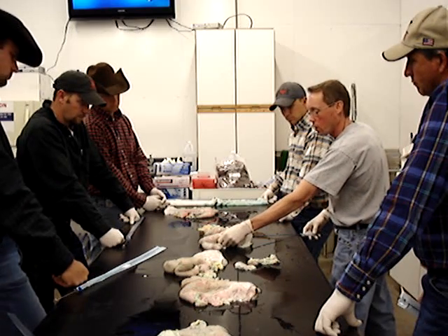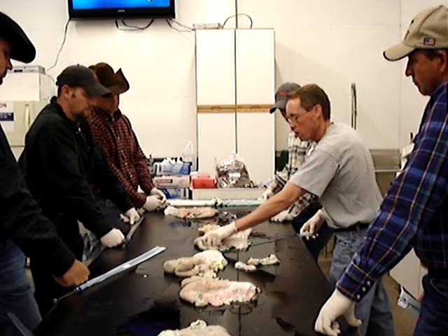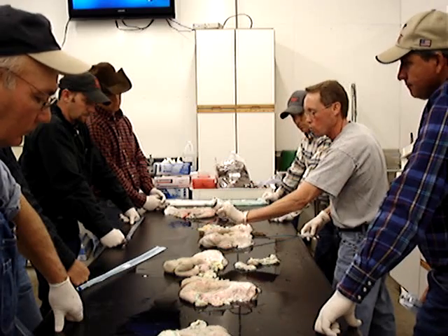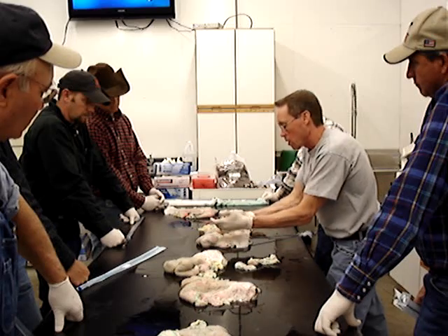When you move it over, you generally start to — my thumb's here, I can tell what I'm doing. There's the split. Where's the rod? It's in between here. I know it's right. Now you feel it — a little compression — and the tip's right in this area.